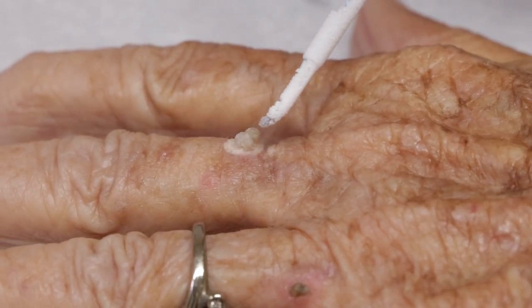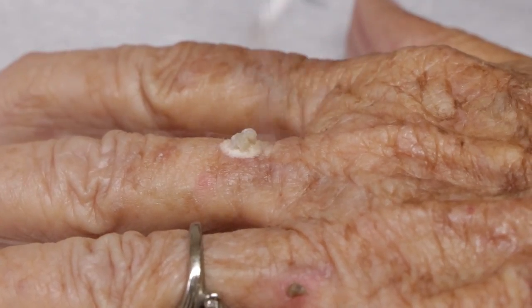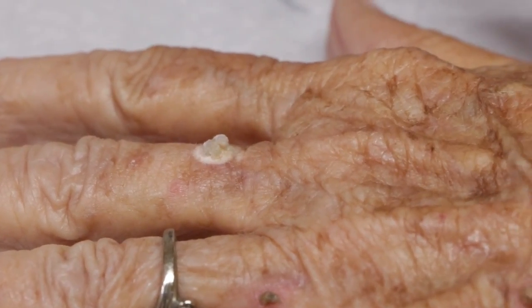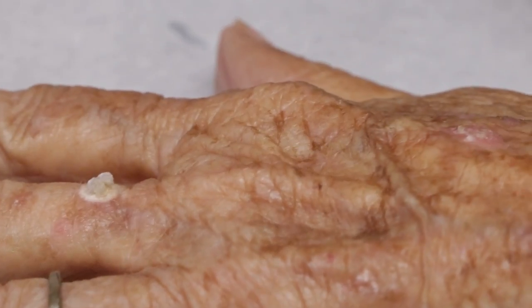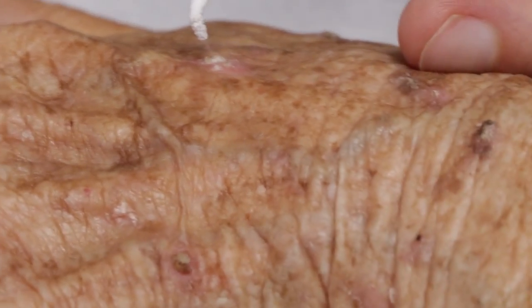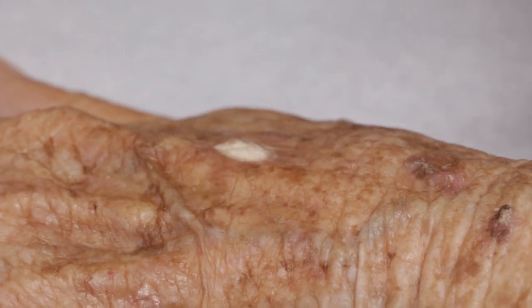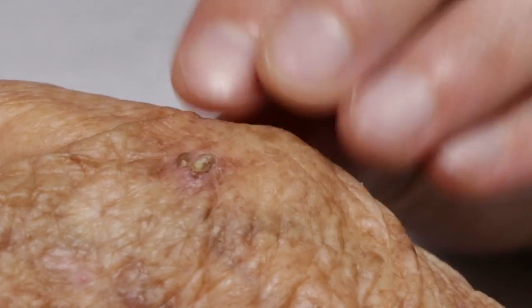When do you want to see me in ten days? Well, to get the suture out, yeah. From that other procedure — people can watch that other video and see what we did; which was actually today. And then this one here — that one we'll just get from one angle. Then we'll turn your hand up on the side because I think that works best to see this pair right here.